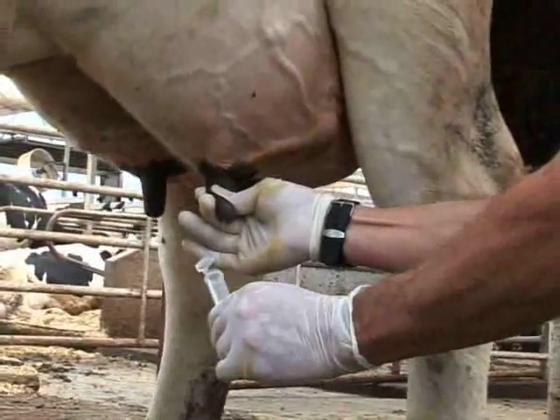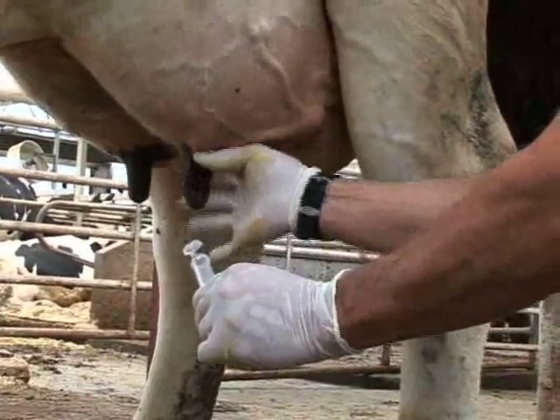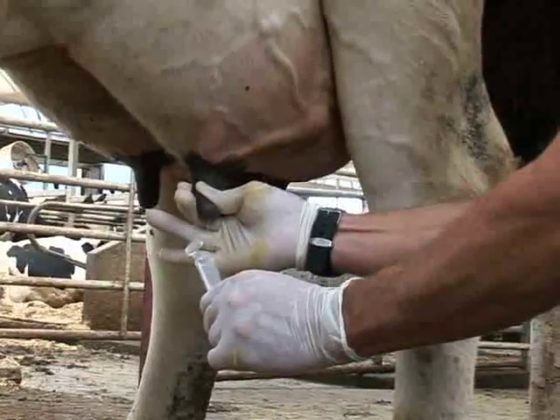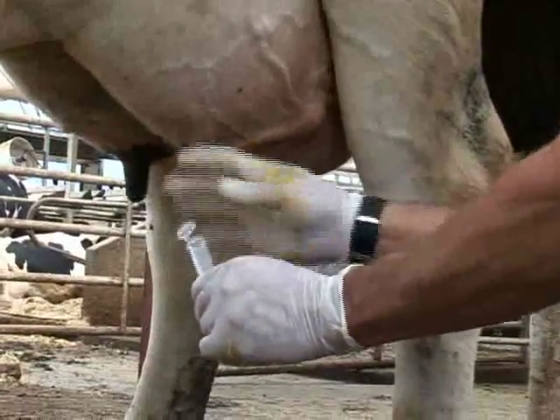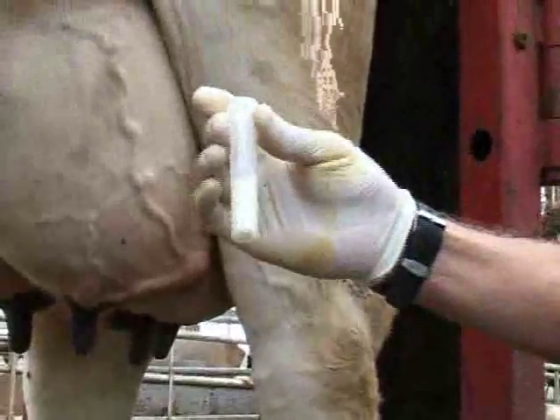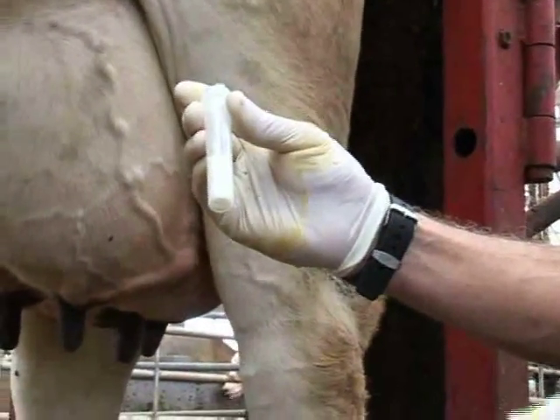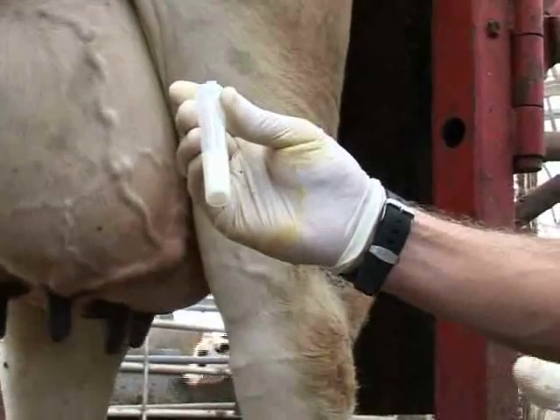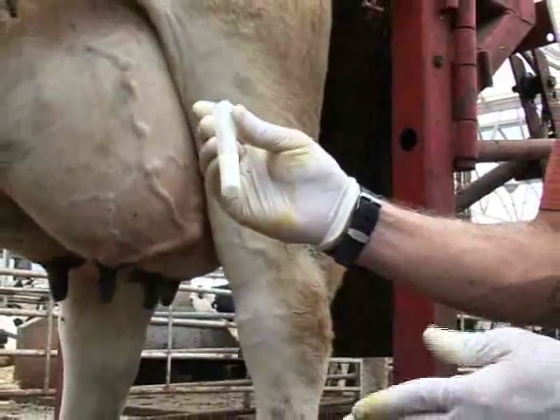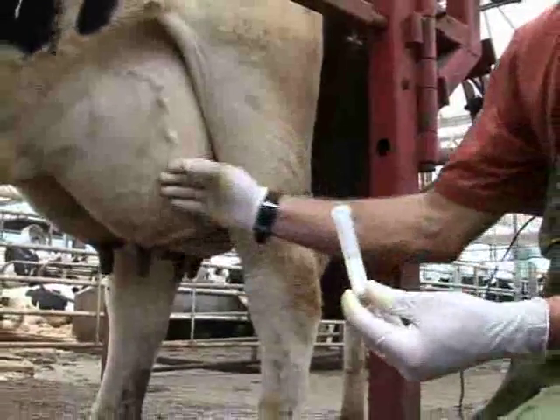Then we fill the tube up with milk — a small sample, at least one quarter of the way up the tube. Then we close the lid and we have our sample vial to turn in for microbiology. Whatever organism grows should be the organism that's actually causing infection in the gland — causing mastitis.